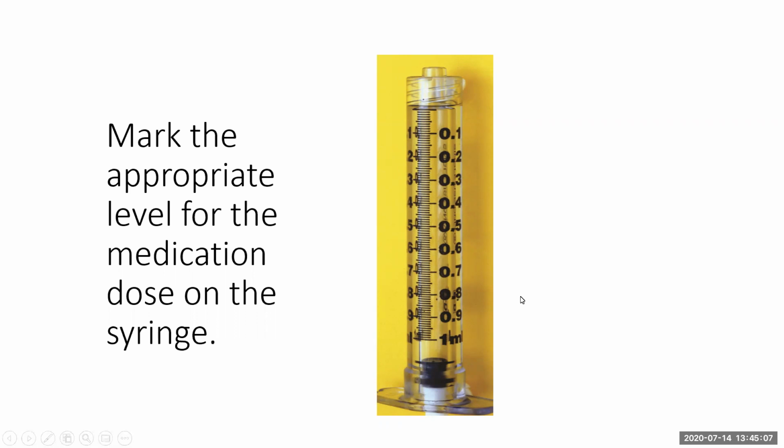Where on this syringe would you mark the level of medication? So where along all these hashes is going to be the amount of medication you will draw up into this syringe to administer to the patient. I'll give you a few seconds.